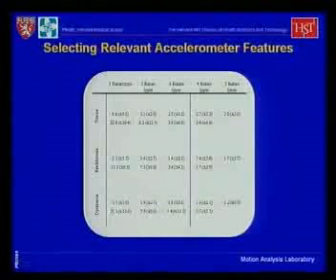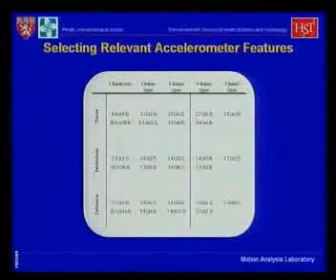So what we are trying to achieve essentially is to see if there are types of features that we can actually estimate by relying on the computational capability of the nodes as opposed to estimating them offline. So that as opposed to storing the entire time series, we can just store features.